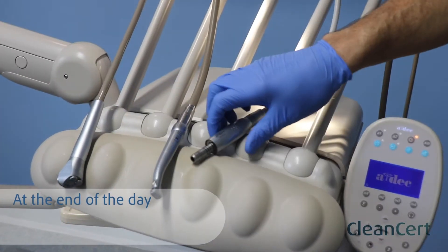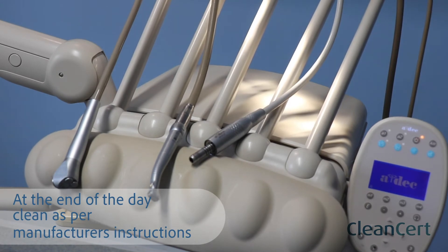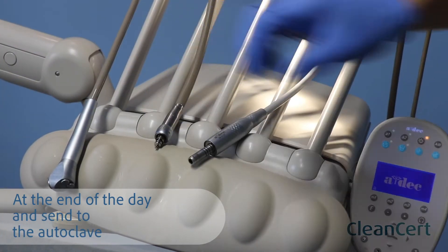At the end of the day, remove your hand pieces and couplings and clean as per manufacturer's instructions and send to the autoclave.